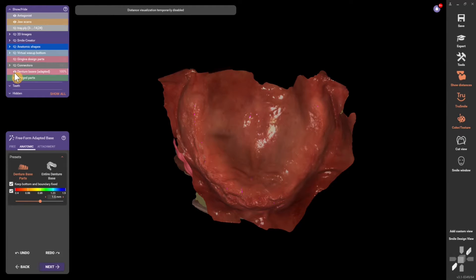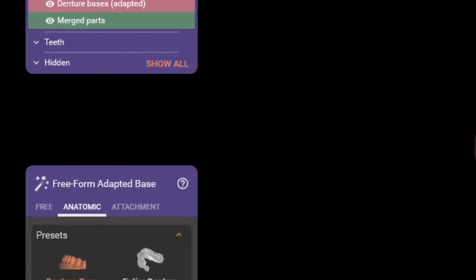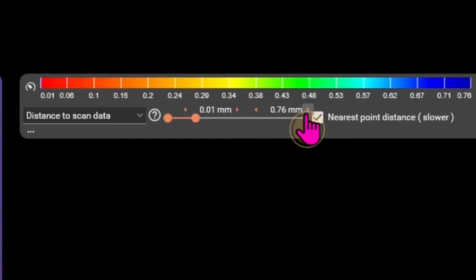On your merged part, click freeform and we're going to add our pressure here. Unclick, keep the bottom boundary fixed and thickness, and turn on over here distance to scan data — nearest point distance.